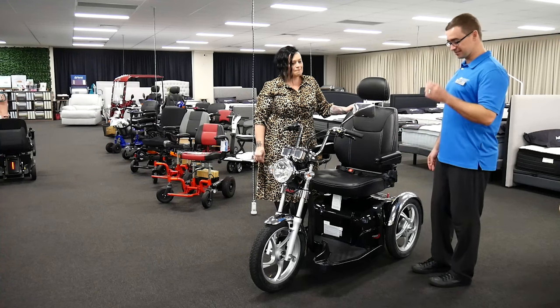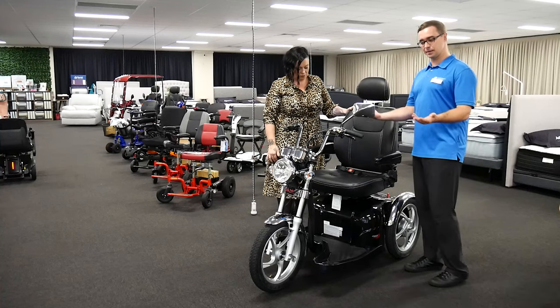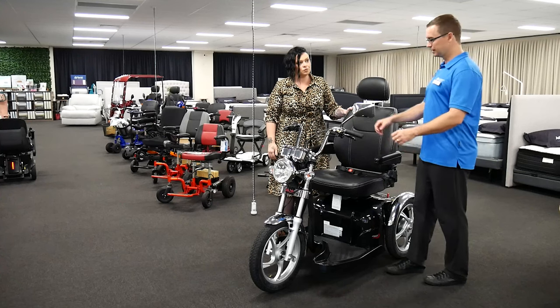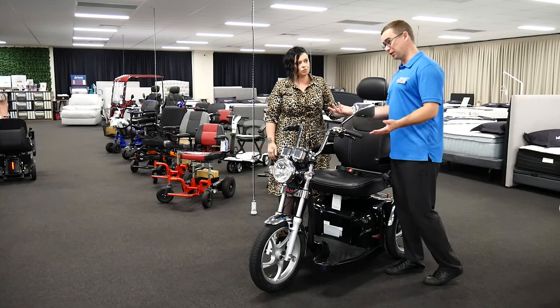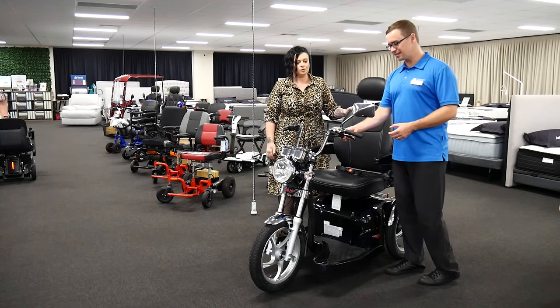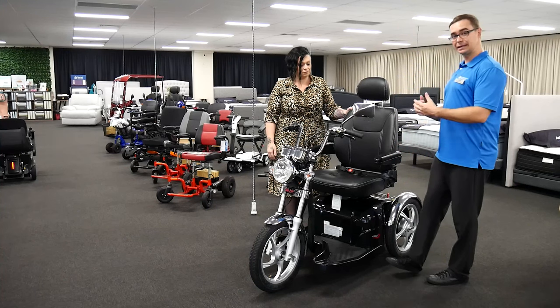One of the first points of difference is aesthetics. It has the same sort of features as a standard mobility scooter — the ability to go forward, go backwards, turn, with lights, blinkers, and a little horn on it. But it's how it looks, and it's more appealing for people.